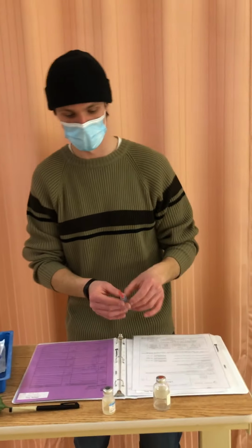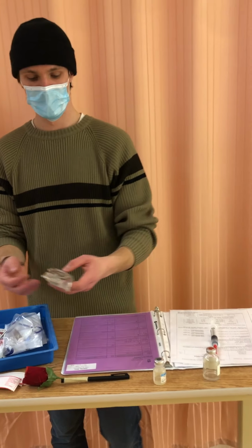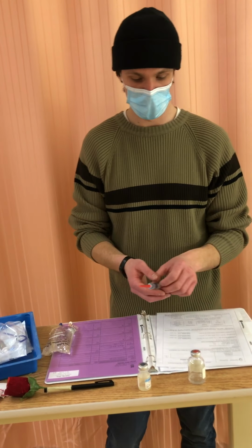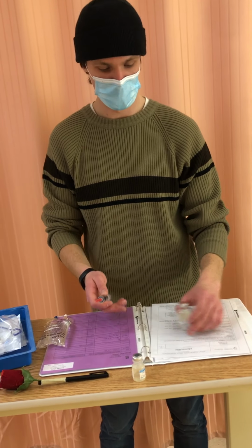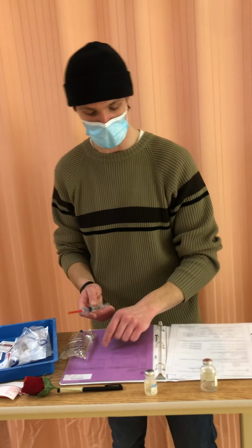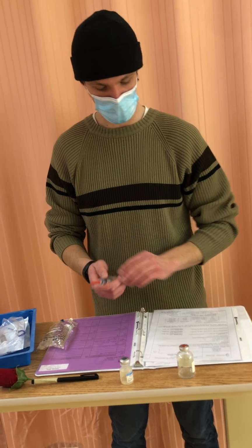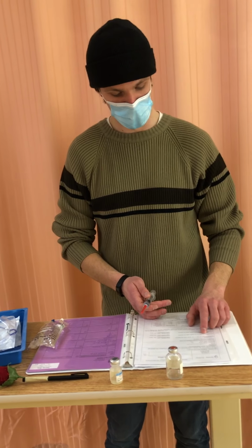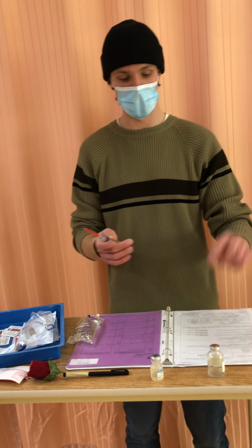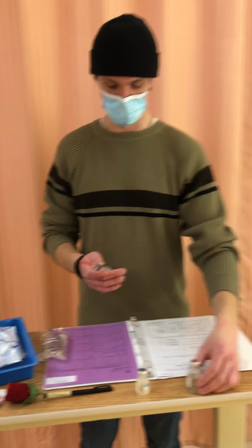And now I'm just going to do my second check before I inject the medication into the Minibag here. So again, I need cloxacillin. This is cloxacillin. I have cloxacillin, and there's cloxacillin on my PDM. This is for Dora Dabney, correct patient, correct med. I need 1 gram. I see here that reconstituted 1 gram is final volume of 4 milliliters. I reconstituted for 2. I had 8 milliliters and drew out 4 milliliters, so correct dose.